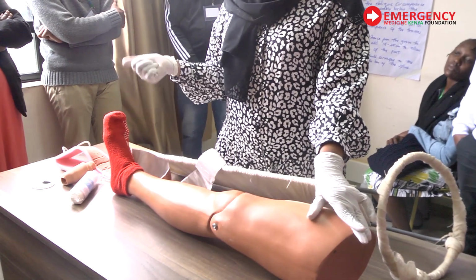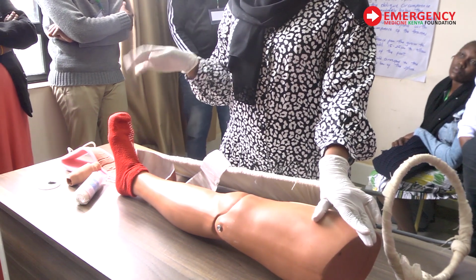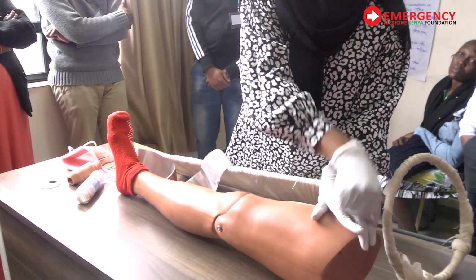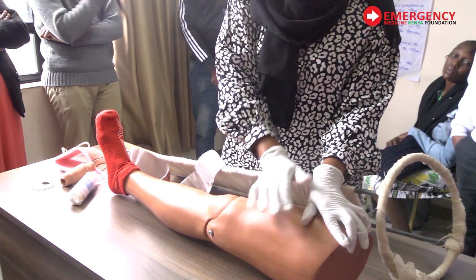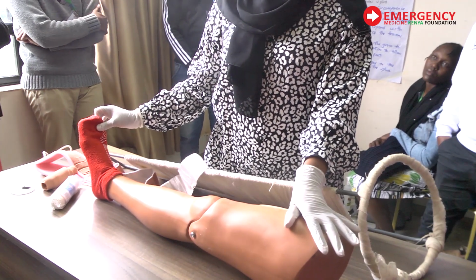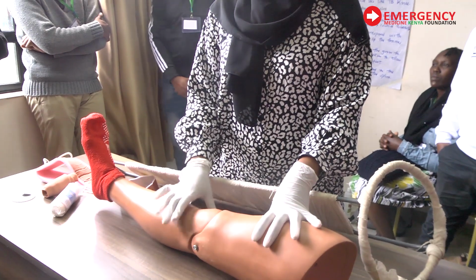So you can take your 10 cc or 20 cc lignocaine, okay, depending on the percentage, draw it, and you go and feel for your nerve. You feel your artery, go laterally, and you infiltrate, and you give your block. Okay, give it 5 minutes for it to work. The patient will be numb. Tell him to move your toes. I'm touching you. He won't be able to feel that. So that's very good, he'll be very cooperative for you to do this procedure.